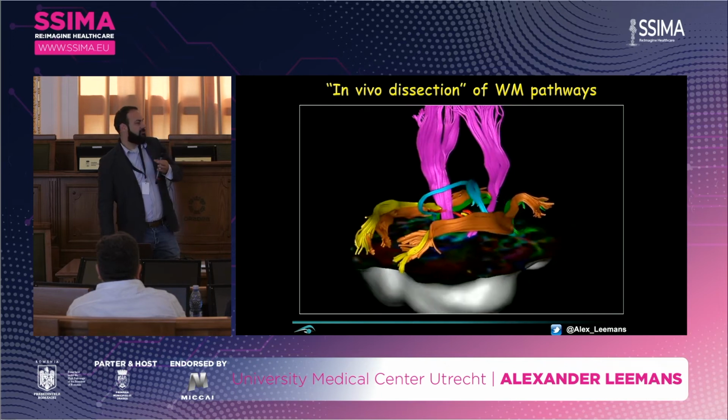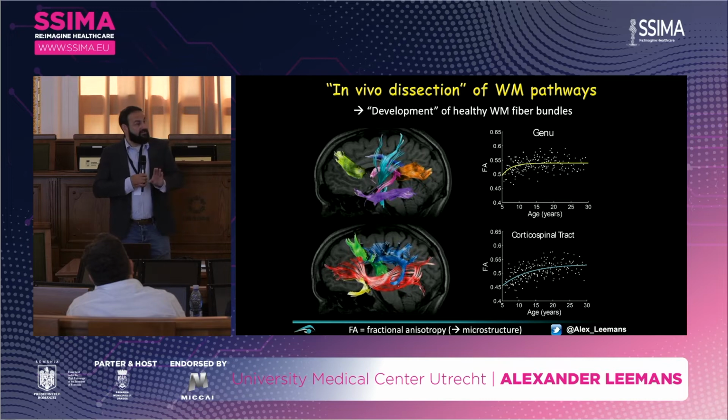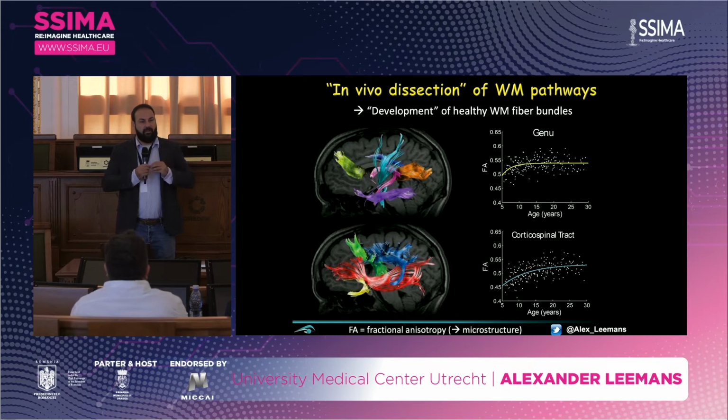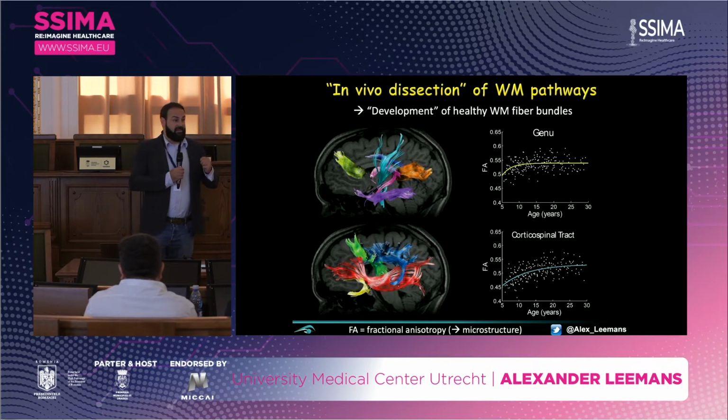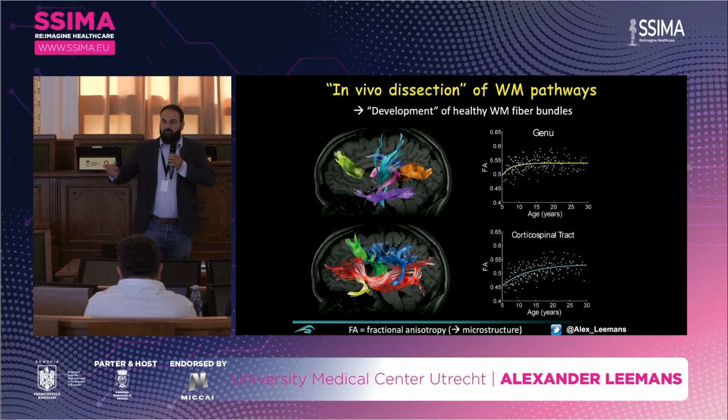And this is just visual, right? We can also quantify properties underlying the tissue microstructure. Again, think, for instance, of the eccentricity of the ellipsoid. Imagine that you have a pathology, right? What happens to your brain? Well, you've got microstructural degradation, right? Let's call it the integrity of the white matter being compromised. So tissue filaments, they break down. Well, the myelin maybe goes away.